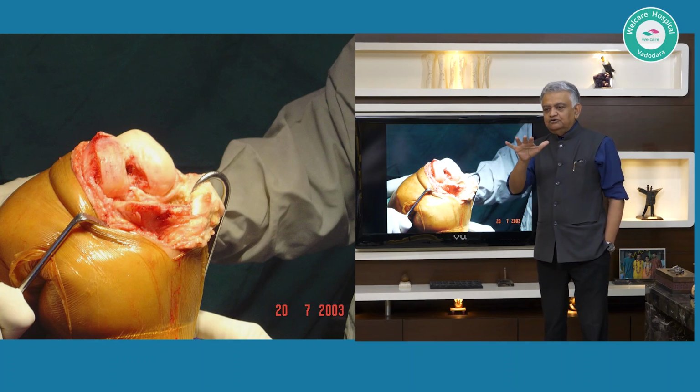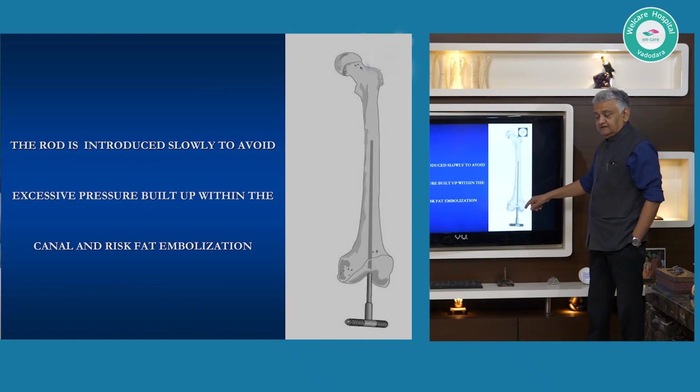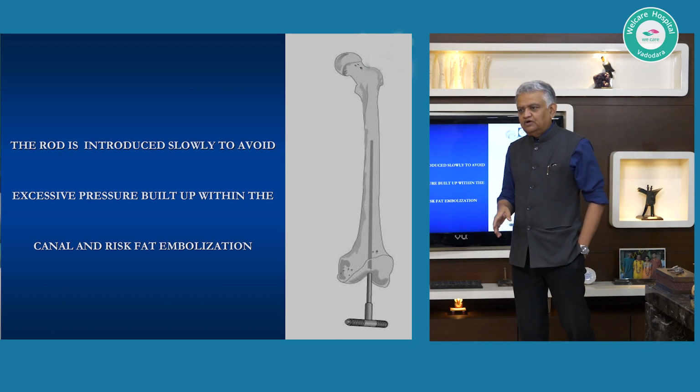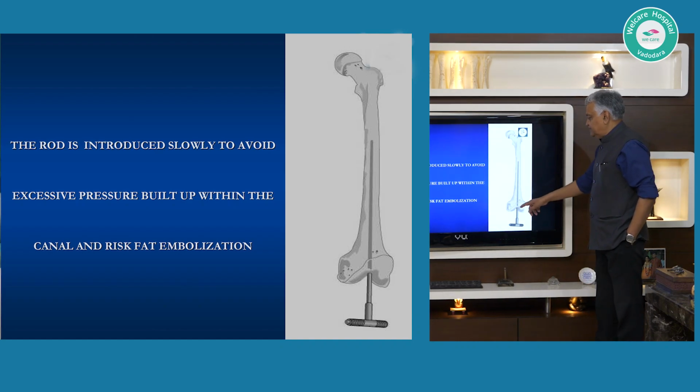Use a tiny thin probe-like thing in the form of a spoon or something to put it in and break the trabecular obstructions, and then put your soft catheter in. If required, do it twice. If your soft catheter gets blocked by bone debris or marrow, there is always a second catheter on the table so that the surgeon doesn't get tempted to say that now it is done, you know. No, be absolutely fastidious about this fact that you have evacuated all the red marrow.